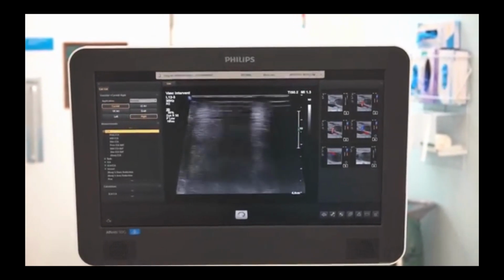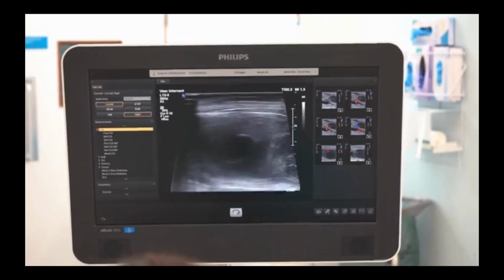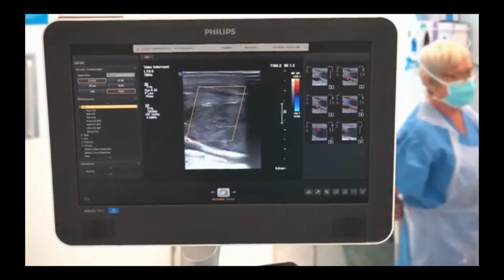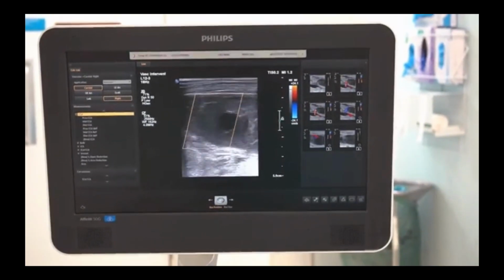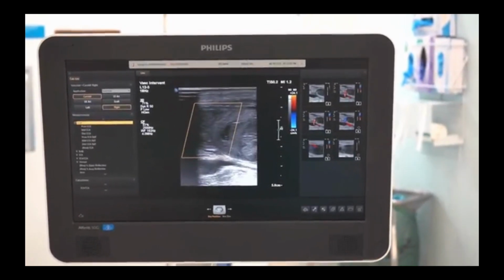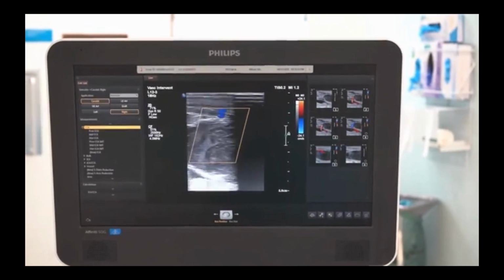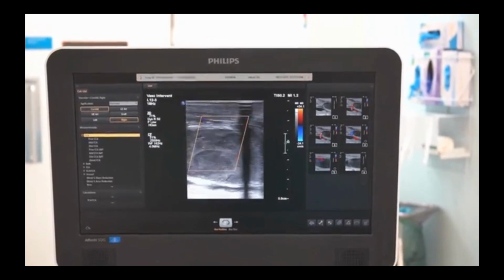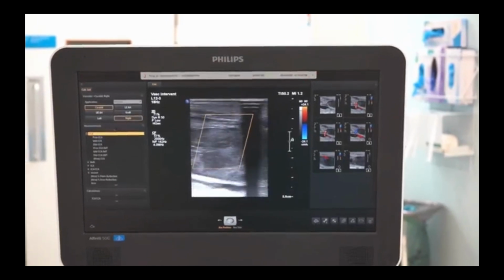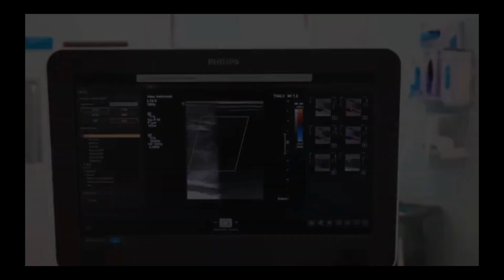And if you look to the deep side of the ultrasound image, you can see that there's still good pulsatile flow in the brachial artery, and the patient had no untoward sequelae from this. We have actually ultrasounded these patients' arteries distally when doing femoral pseudoaneurysms, and we've not seen any distal embolization picked up on ultrasound. So very safe, simple technique, even in the upper limb.